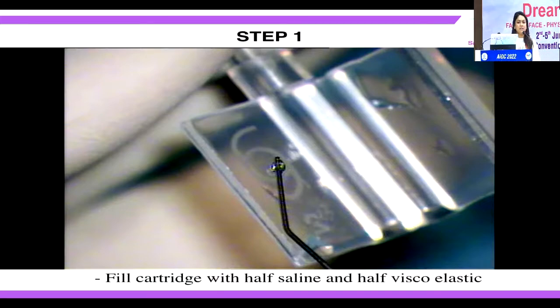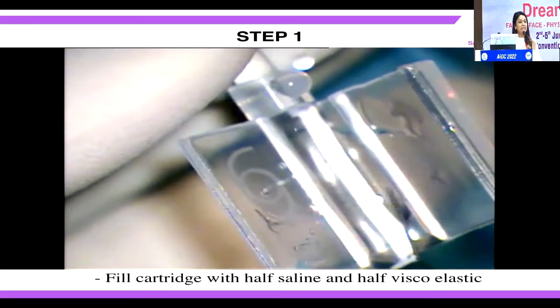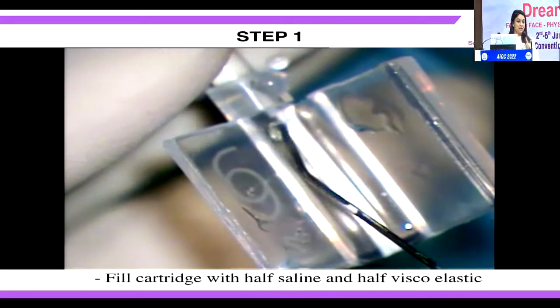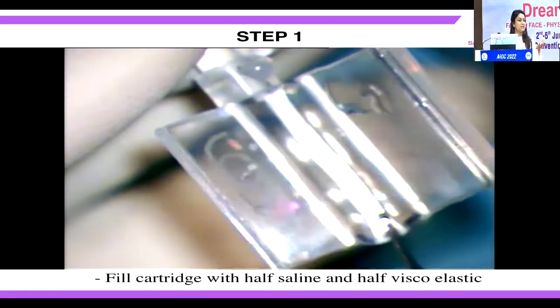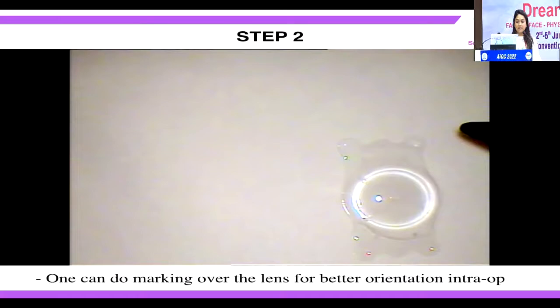Loading of an IPCL is fairly simple. It's just like any plate haptic PCIOL. Very important thing is, don't completely fill the cartridge with Visco. Fill it partly with Visco and partly with saline, because if the cartridge is filled with excess amount of Visco, it can lead to flip.